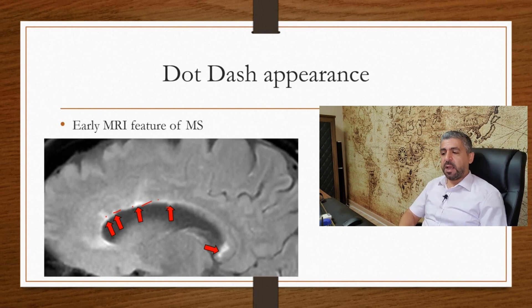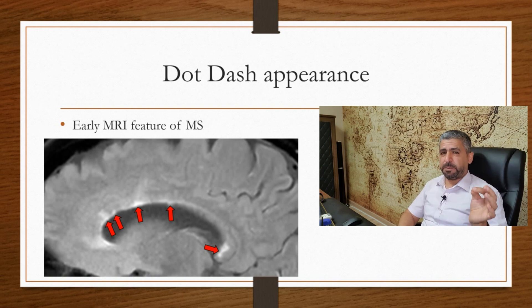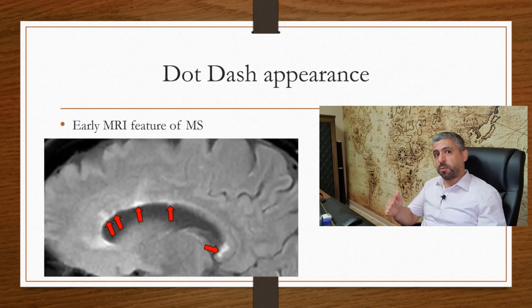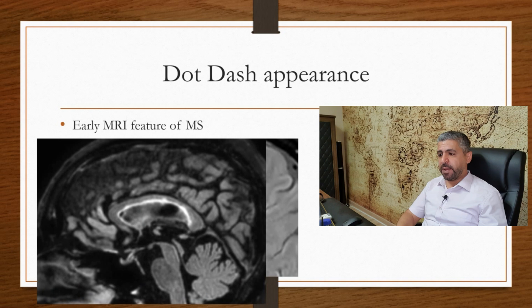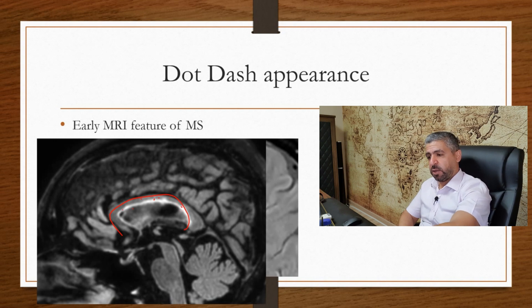It represents subcallosal subependymal areas of T2 signal hyperintensity. Performing sagittal FLAIR — fluid attenuation inversion recovery — sequences is very helpful in patients with MS, so try to obtain those if you are suspecting MS. This is a very progressed type of dot-dash appearance; they tend to coalesce with time, forming a continuous line with some nodularity.